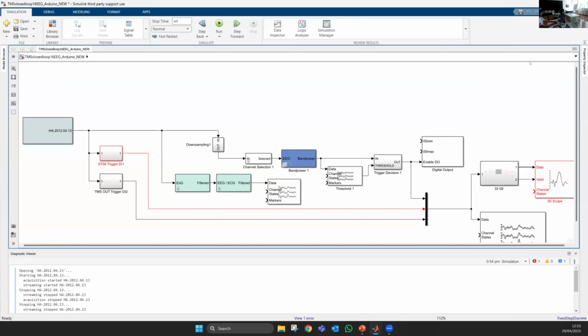Here, timing is very often the main issue, but with defined setups, you can reach quite good timings, like we saw with 9 to 10 milliseconds. We have to investigate this further. So this is still prototyping, where we can maybe get better results and do more studies and recordings mainly on that.